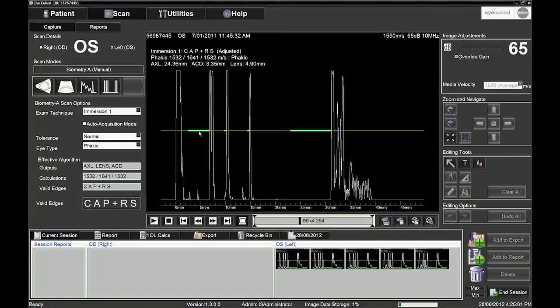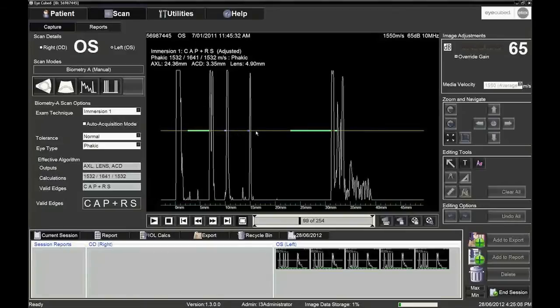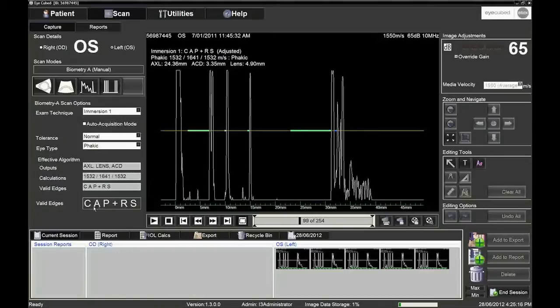You can observe on the screen that the markers or calipers are positioned just before the rising edges and all the letters are in uppercase, so all the freeze and measure criteria are correct.